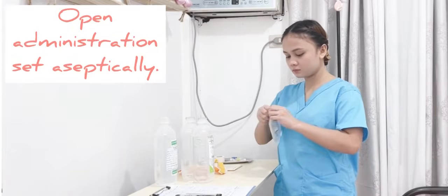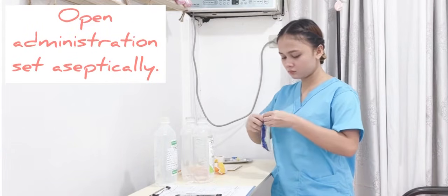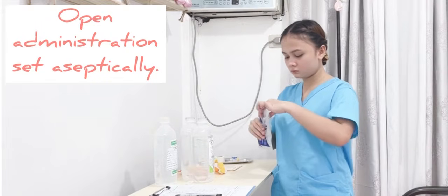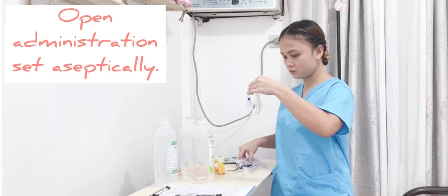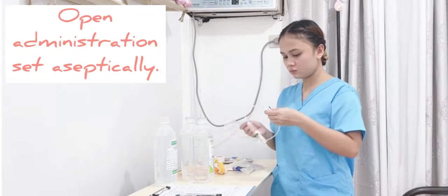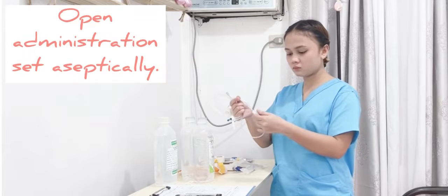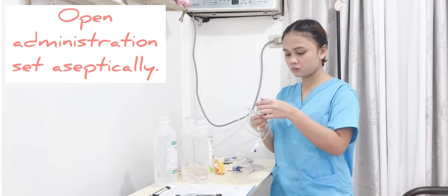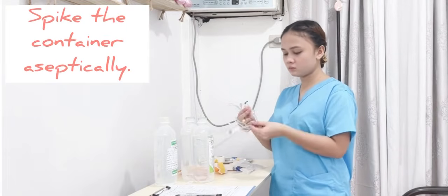Next one is to open administration set aseptically. Open sterile package using sterile aseptic technique. Then close the roller clamp or the side clamp on the IV administration set. Remove the cap from the spike on the administration set.